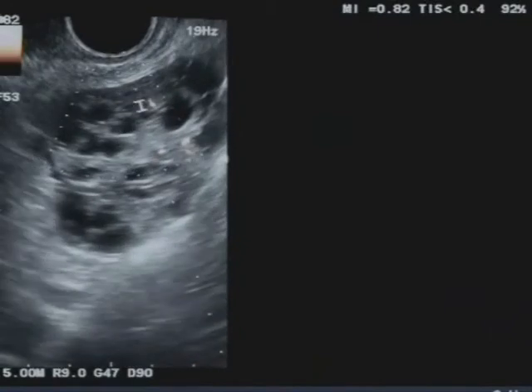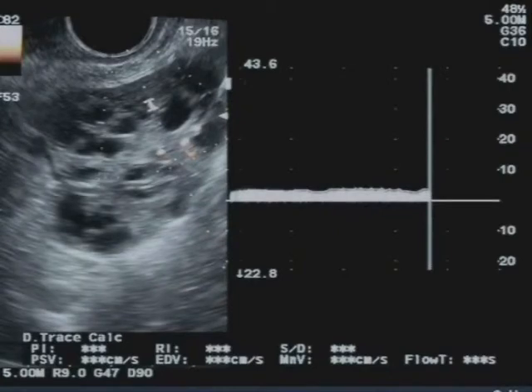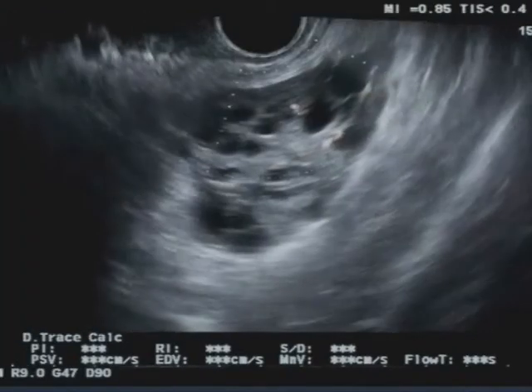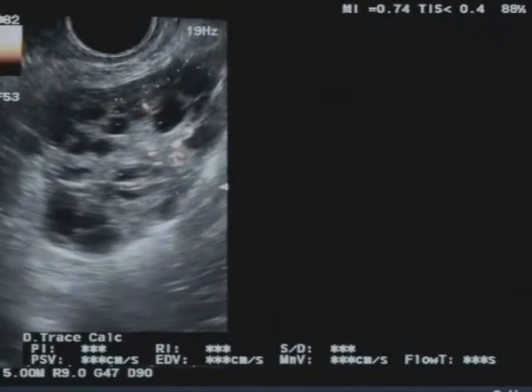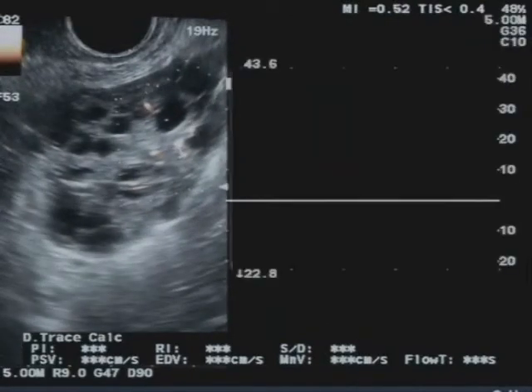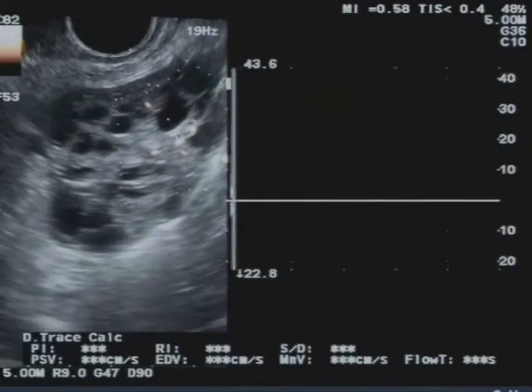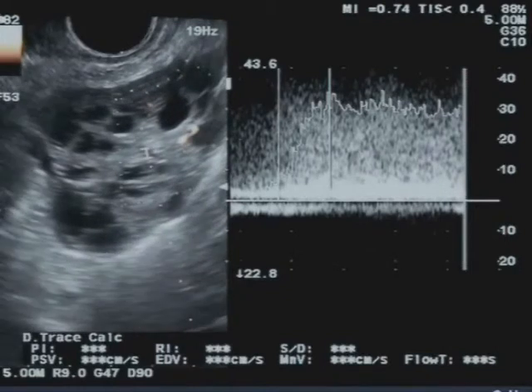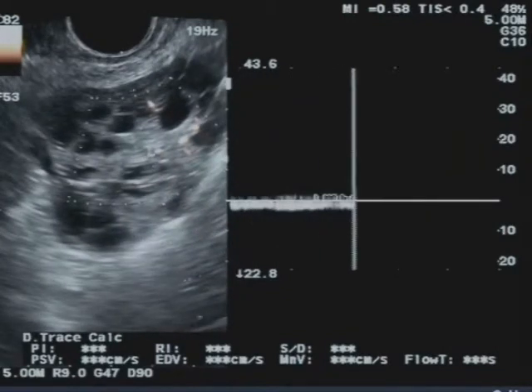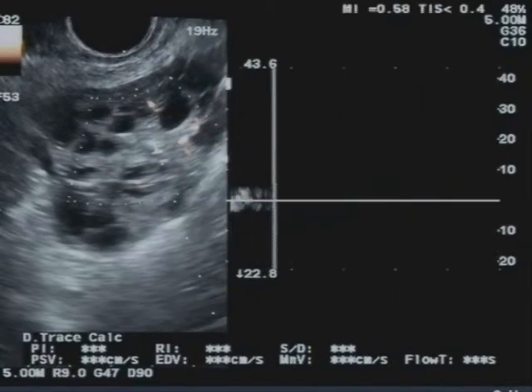Our assessment starts with the specification that pedunculated uterine angiofibroma is a rare disease usually seen in patients of fertile age, while the patient was observed by us in menopause for about 5 years. The data that we have to show, beyond the age of the patient, is the clinical history.